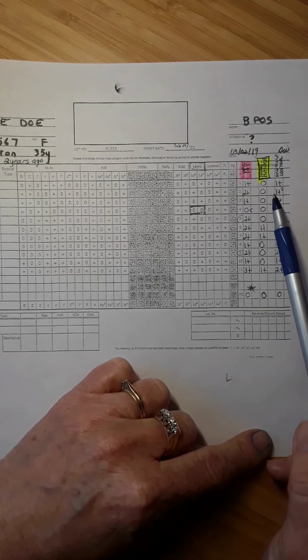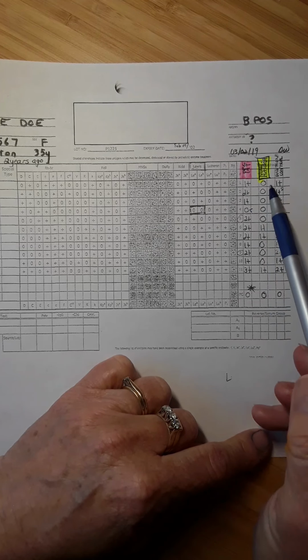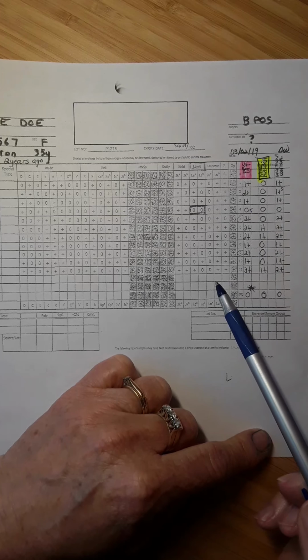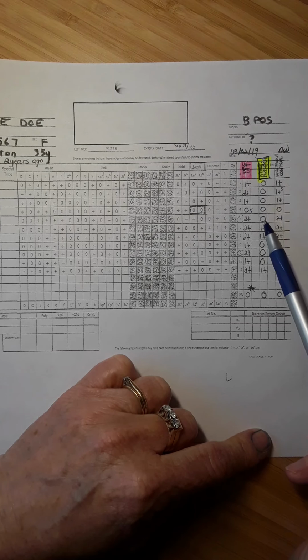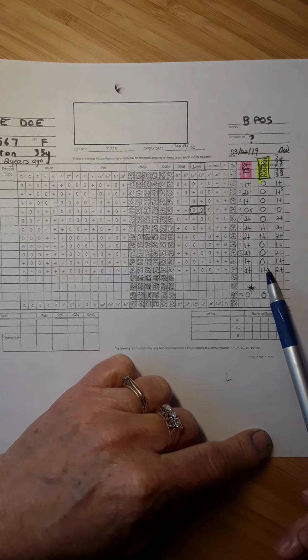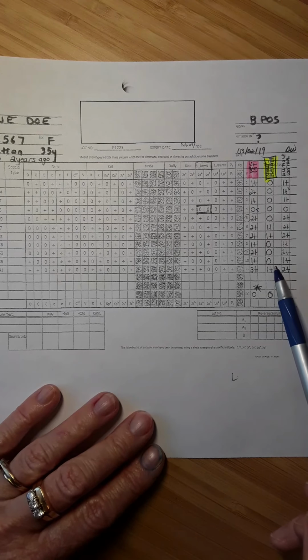So now in the neutralized plasma, I do have a lot of negatives and some positives, and it's easier once you have more negatives to see some sort of pattern. So what I mean by pattern is that I have a negative, negative, negative, negative, negative, positive, positive, negative, negative, negative, positive. Is that pattern what would be expected of any particular antibody in this patient's plasma?